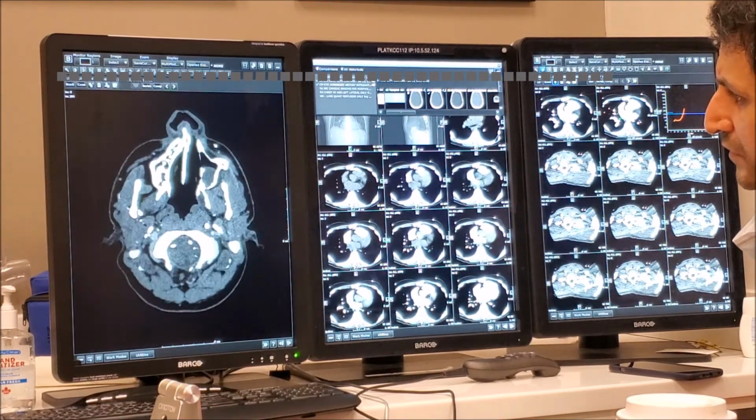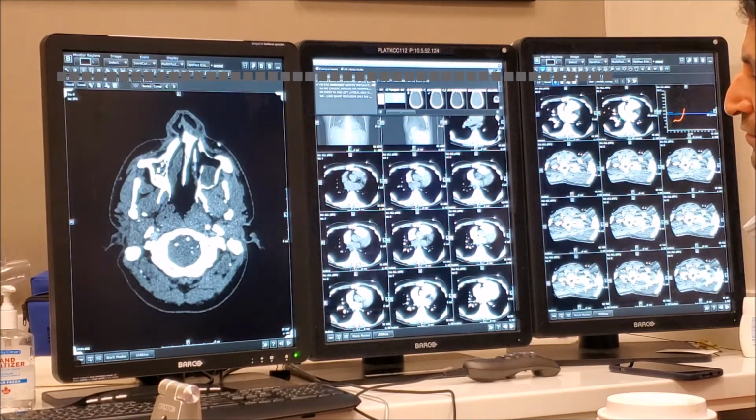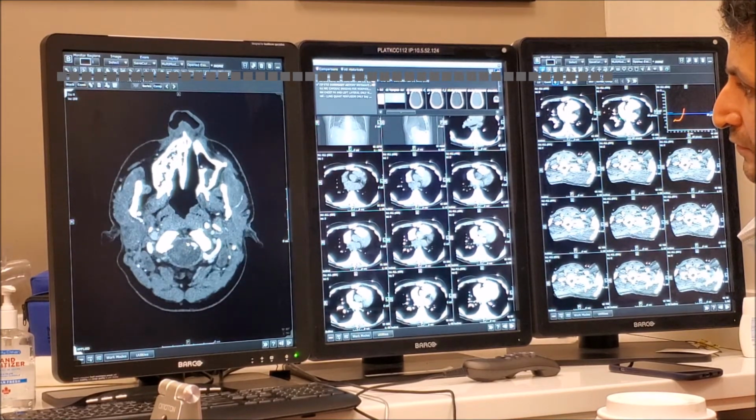So one thing we noticed here, or soon we notice it. So what, you got too many vessels down in these? Yeah, so this is higher neck. The ICA is asymmetric, thread-like ICA on the right side, vertebral, okay.